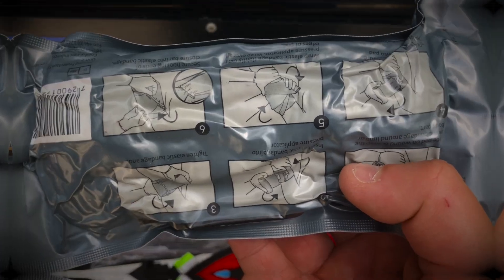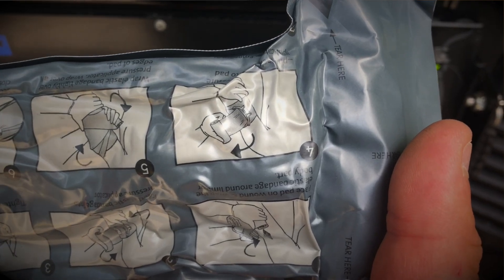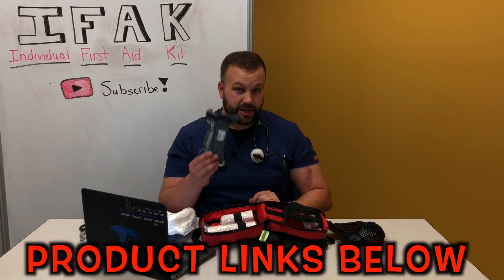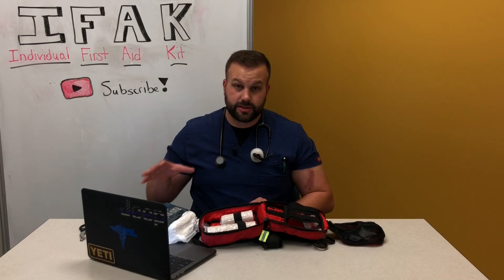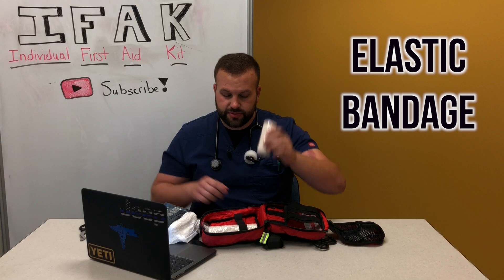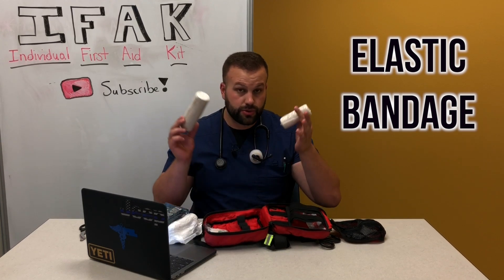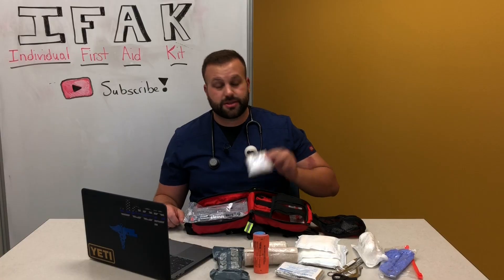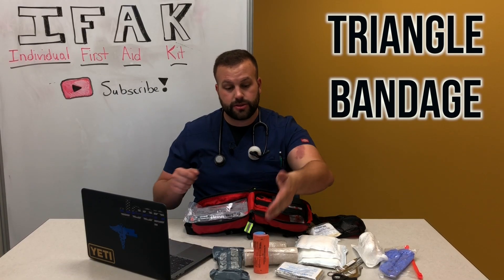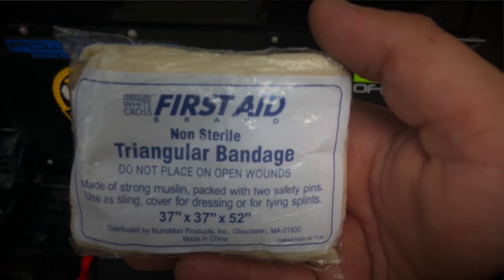Next up is an Israeli bandage, also from North American Rescue. This is great if you don't have the biggest of wounds on an extremity — you pack it with gauze and then place this over it as a bandage that applies pressure for you. I also carry a couple of different sizes of elastic bandage — really good and super elastic. And a triangle bandage, which is great for making a sling if you've exhausted your SAM splints or run out of gauze.